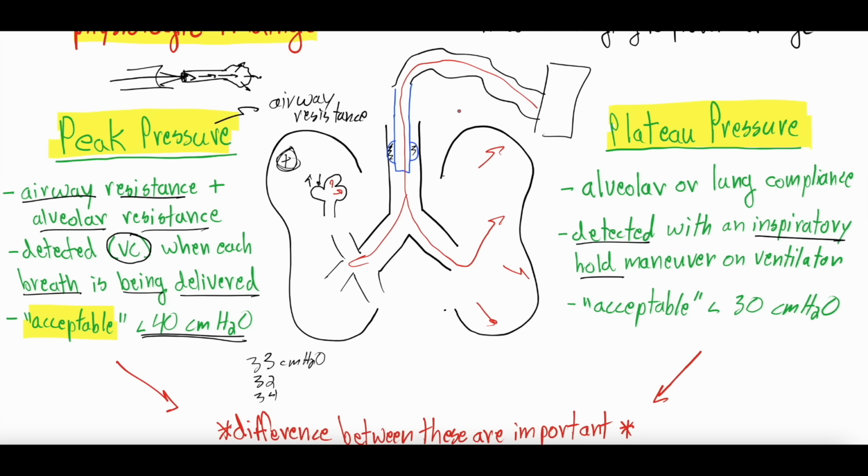So just picture it. It's essentially if you took your own breath in, and then you just held it in your lungs. You're not letting any air in, you're not letting any air out. You can almost feel the pressure in your chest when you do that, right? Because your lungs are inflated, and your lungs are tissue. So as the air is pushing those lungs out, the lungs are also pushing back in. They're trying to deflate back down. And if you're not letting any of that air escape, the plateau pressure is the pressure that the vent is feeling as those lungs try to deflate when we won't let them.